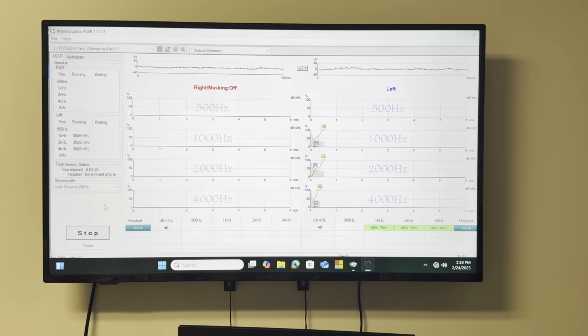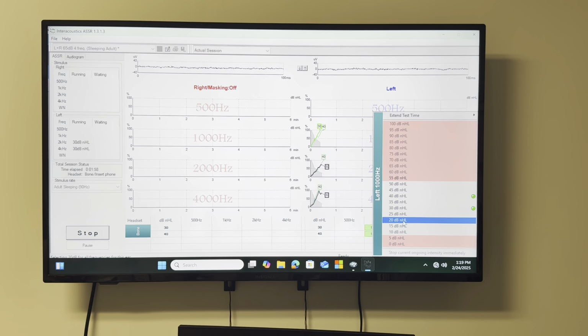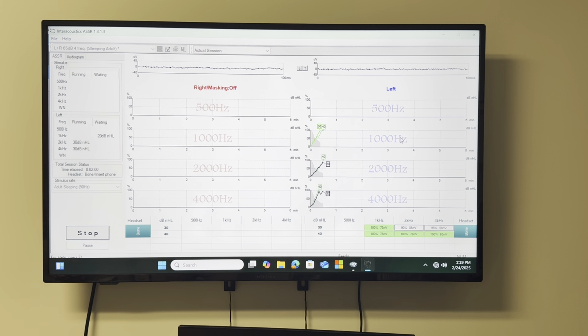Because of acoustic radiation, with high frequencies, the bone conduction sound bounces off the head, and some of the sound leaks out into the air. Mostly high frequencies. So that's why, see now, when the 30 is reached, it'll stop. So that is called acoustic radiation.